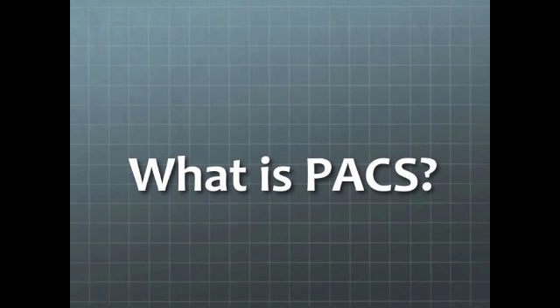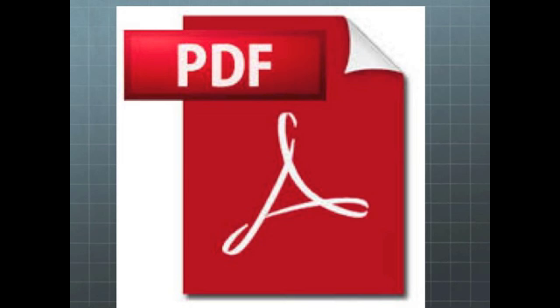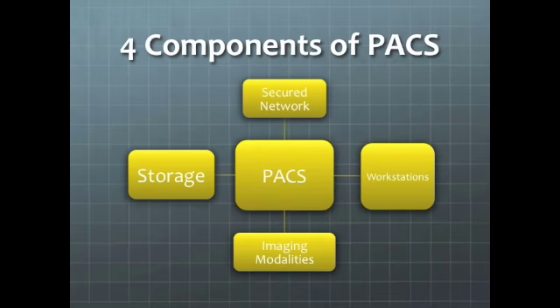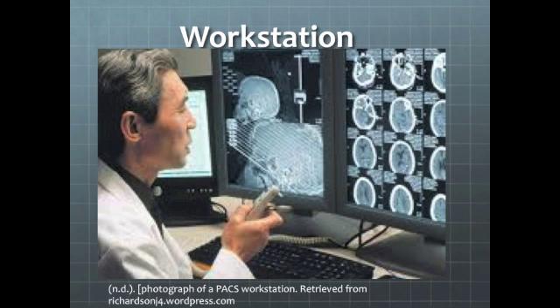The universal format for PACS image storage and transfer is DICOM. DICOM stands for Digital Imaging and Communications in Medicine. Non-image data is sent in PDF format. PACS consists of 4 components: storage, secured networks, workstations, and imaging modalities.